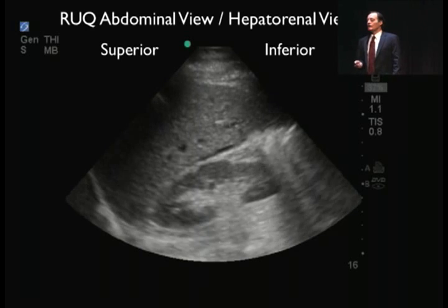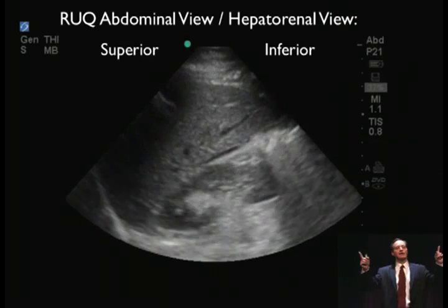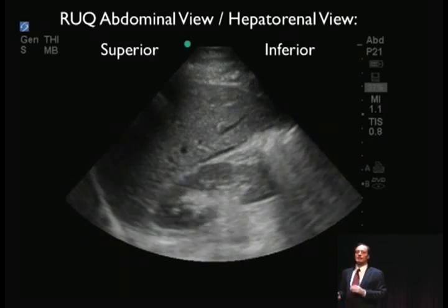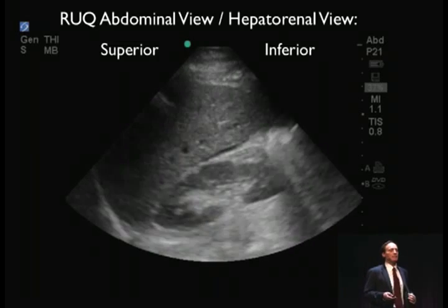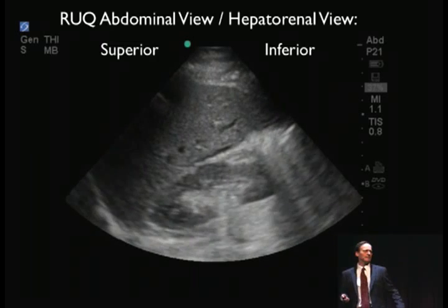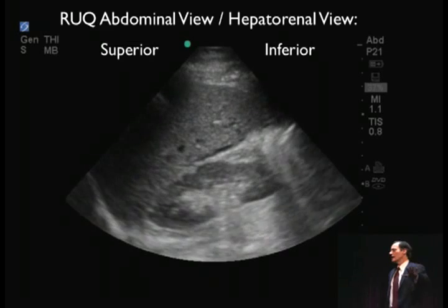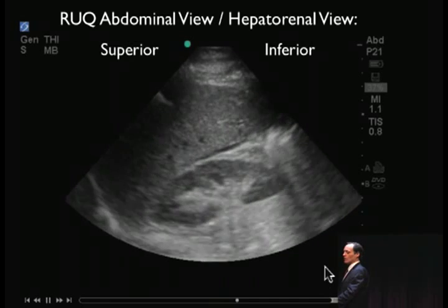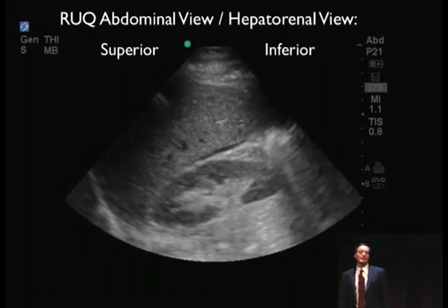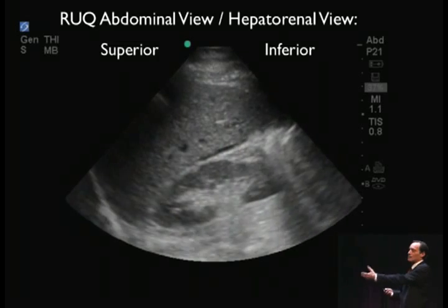Okay, so now, this is a patient who was actually stabbed with a really, really big knife, and he comes in. His blood pressure was about 120 over palp. Here's the examination. Positive or negative FAST exam? How many say positive? How many say negative? You guys are right on the money here. This is subtle, right? You can see that there's only a small amount of fluid layering right there. So a subtle amount of fluid, but as I told you, it can take 600 cc's of fluid to make it positive. So this was actually significant.